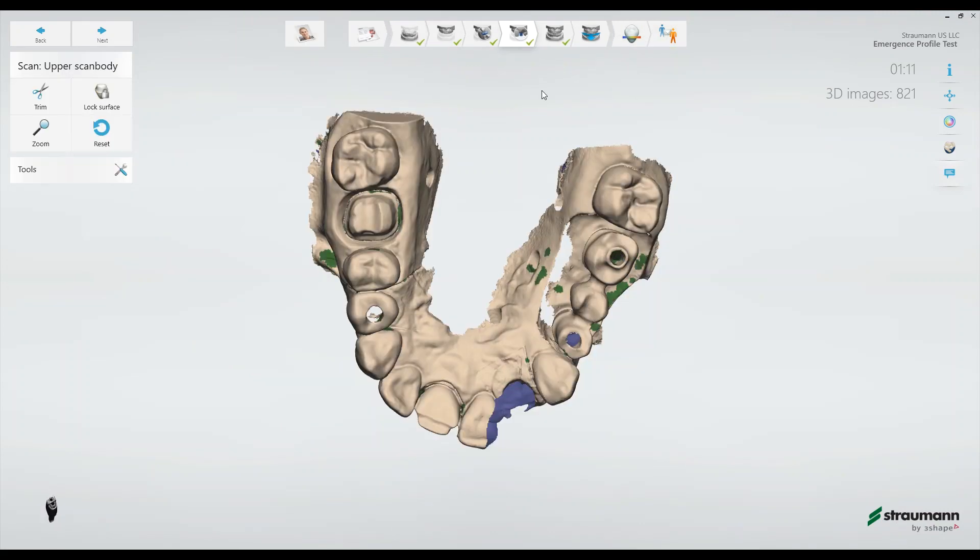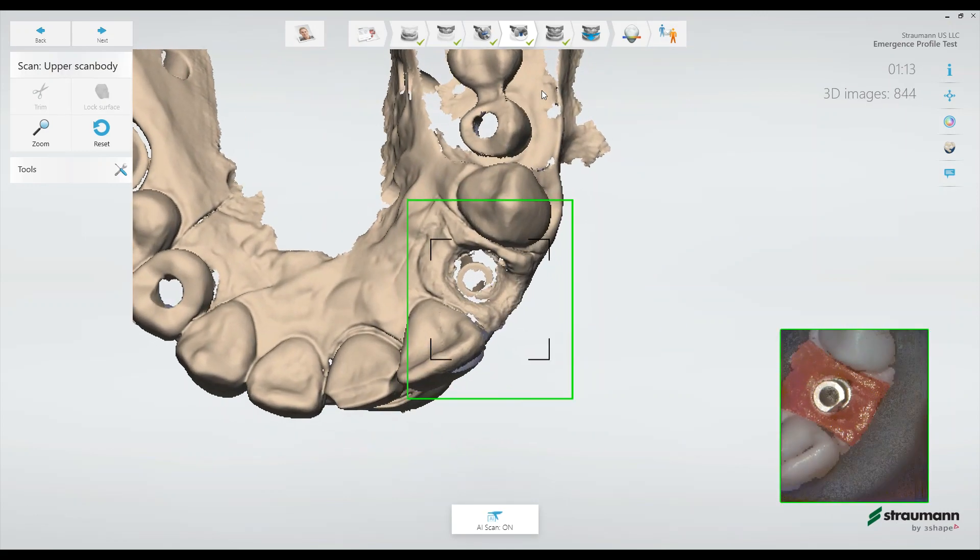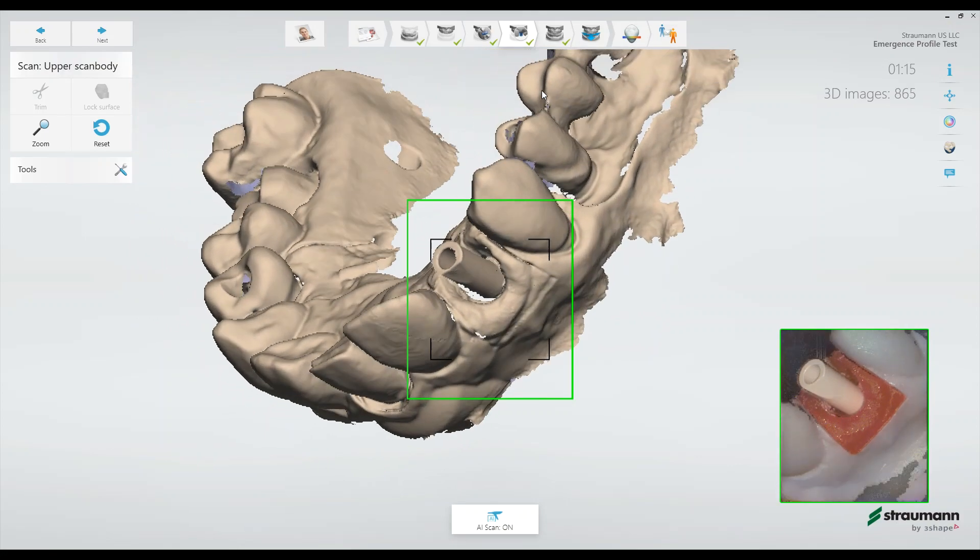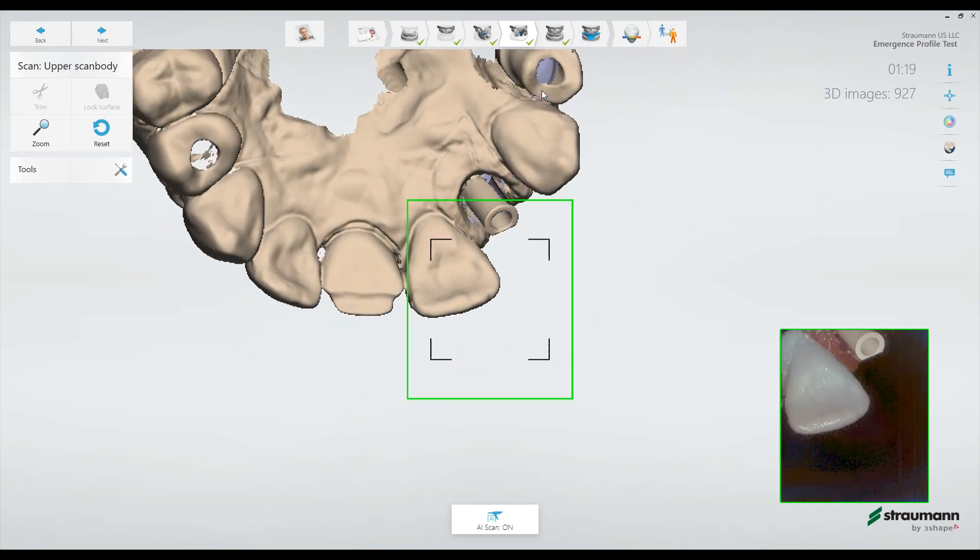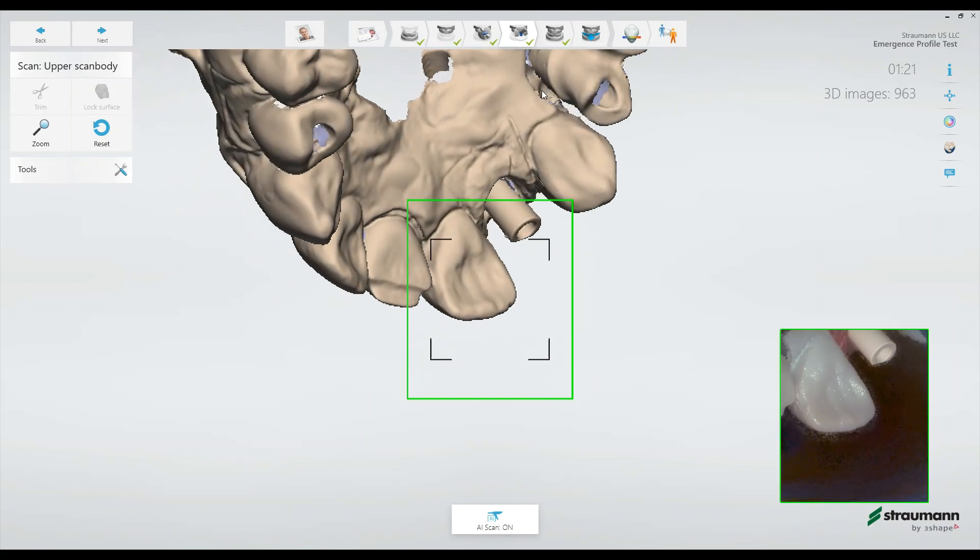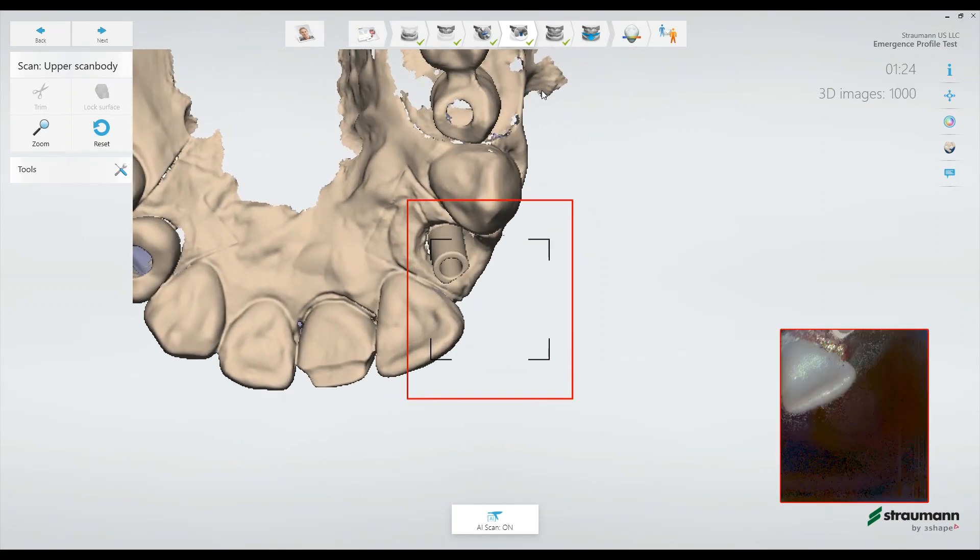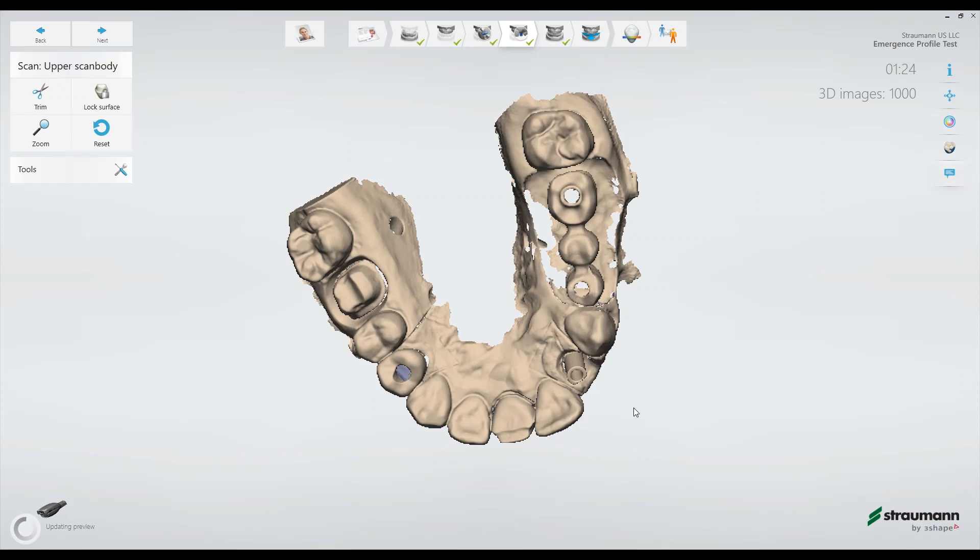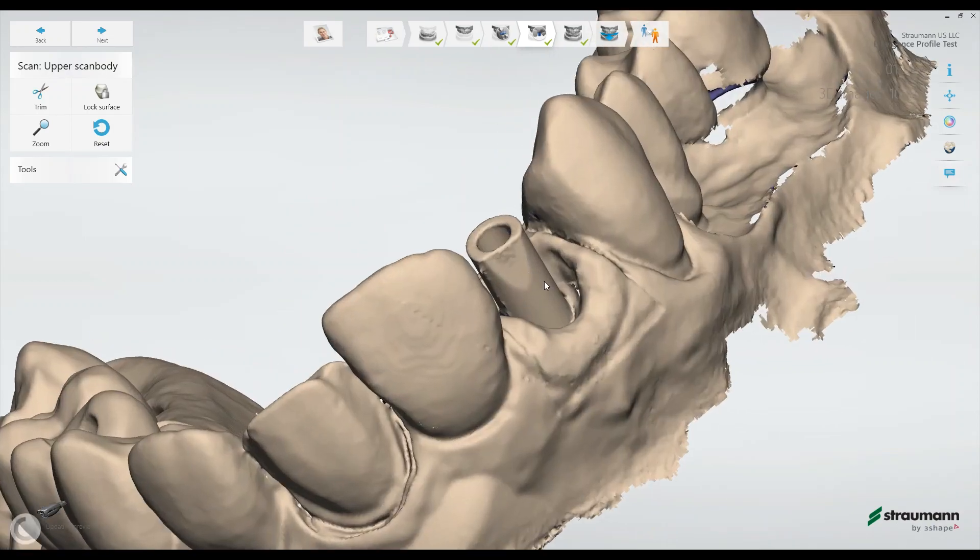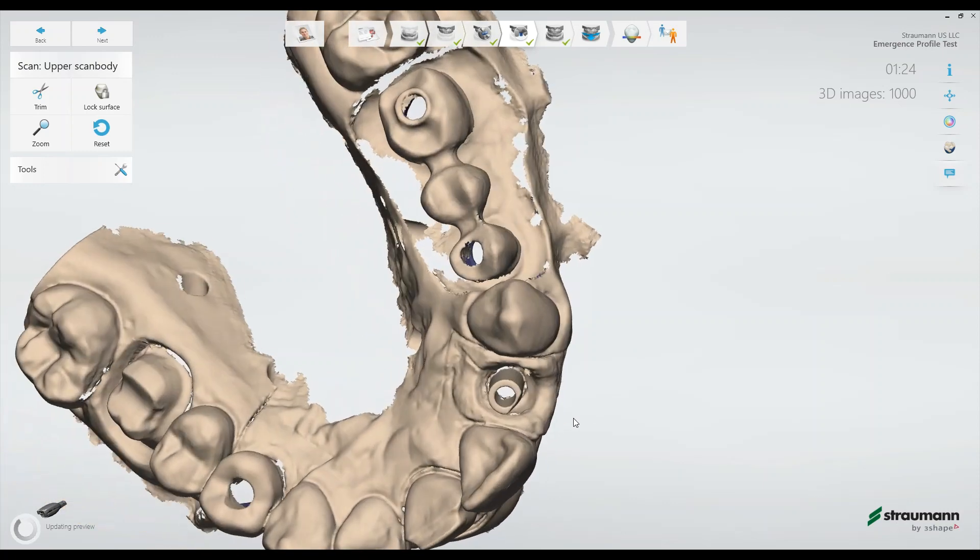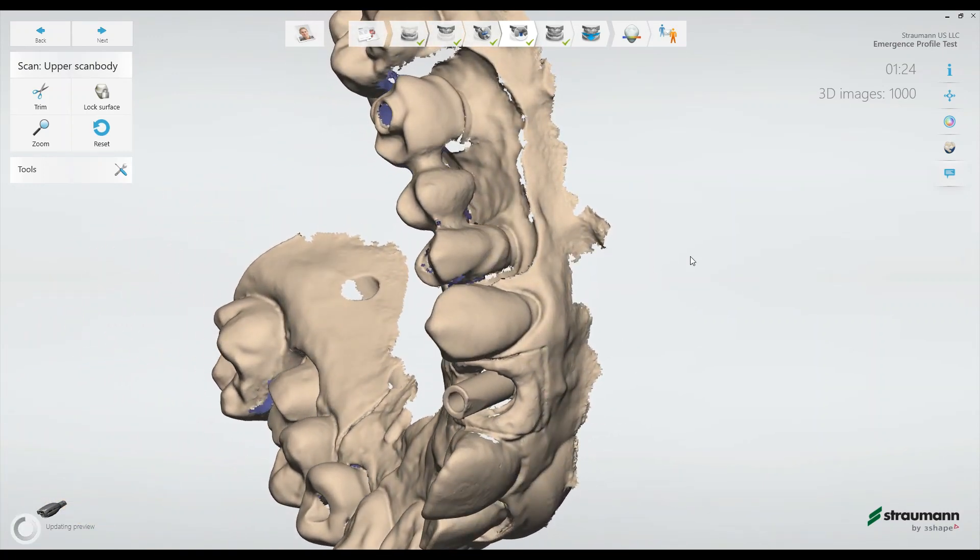I prefer to leave the color model off when I'm scanning the scan body so we can see the geometry of it if it's actually captured perfectly.